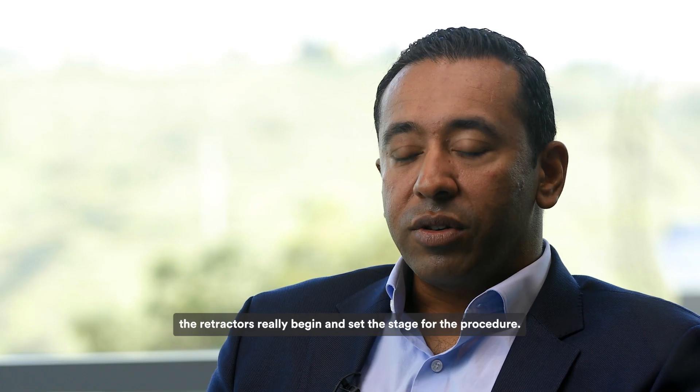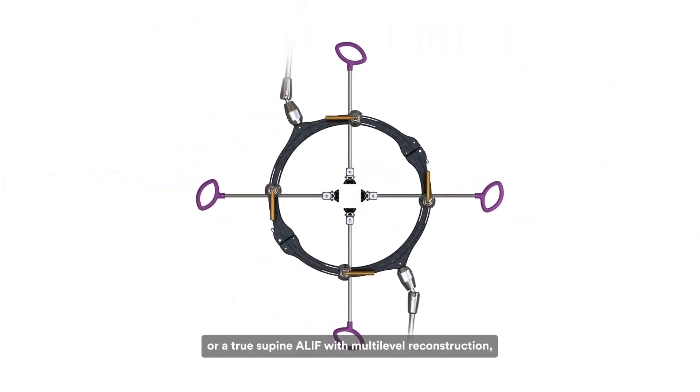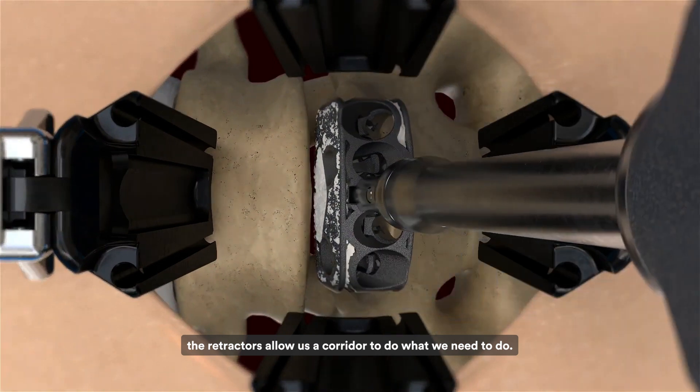When we think about the NuVasive anterior column portfolio, and specifically for anterior lumbar interbody fusion, the retractors really begin and set the stage for the procedure. Whether we're doing this as an XLIF procedure in the lateral position, or a true supine ALIF with multi-level reconstruction, the retractors allow us a corridor to do what we need to do.